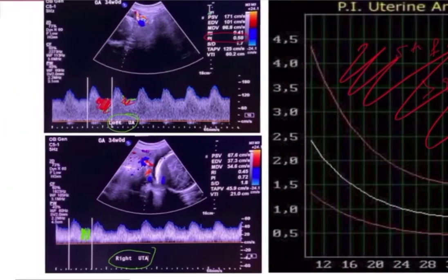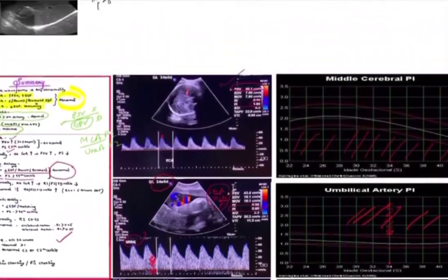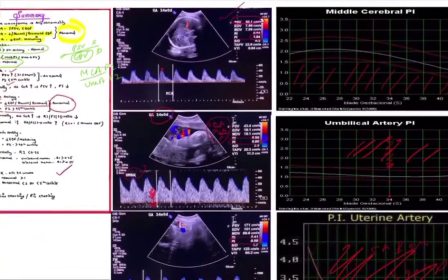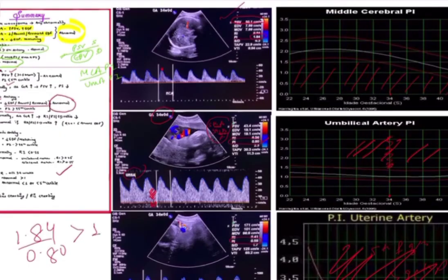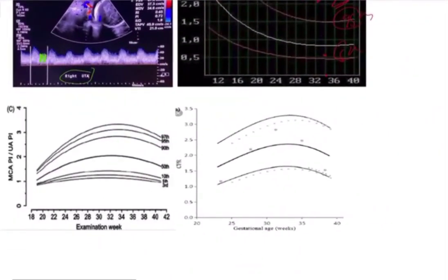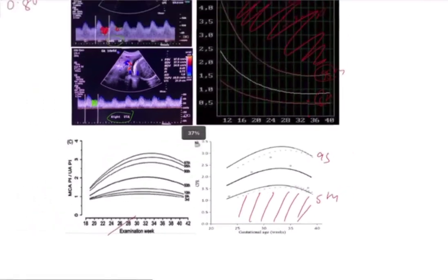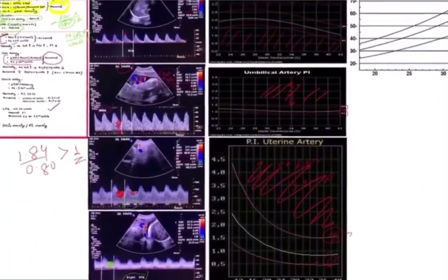Finally, look at the Cerebro Placental Ratio, which is assessed up to 34 weeks. Normally the ratio should be more than one. If it is less than one or less than the 5th percentile, it is absolutely abnormal. In this case, the MCA PI is 1.84 and the umbilical artery PI is 0.80, giving a CPR greater than one — this is normal. You can also plot this on a CPR graph and compare to the 5th percentile.